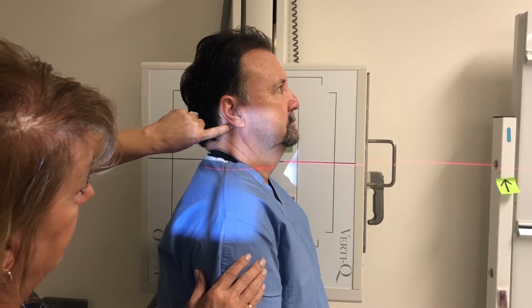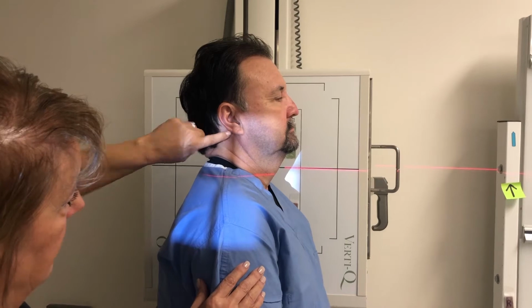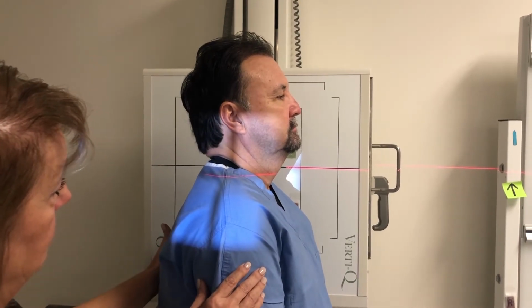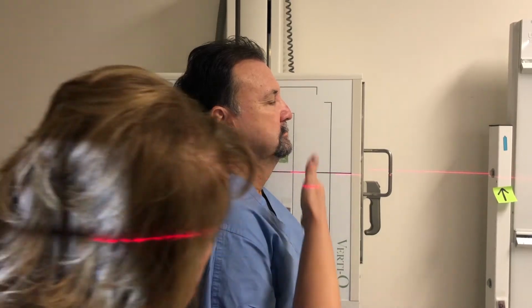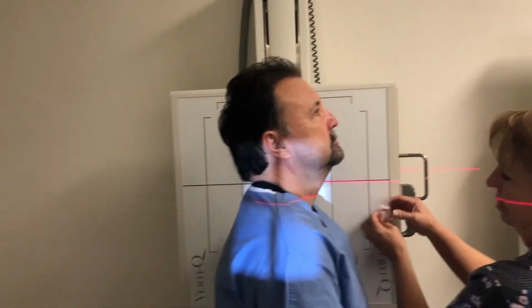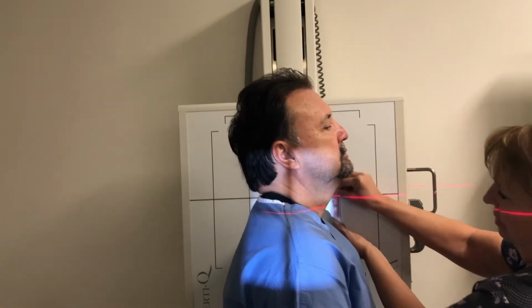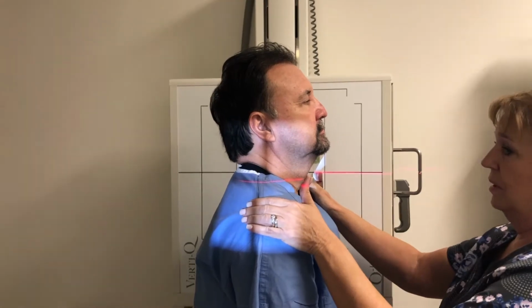So if you have him centered on the mastoid tip, you're roughly right on the mid-coronal plane. I want to make sure I have light in the back, light in the front. I'm going to place my marker. I would place it down lower in the middle. Here's a good spot because I know his anatomy is not overlapped in any way.